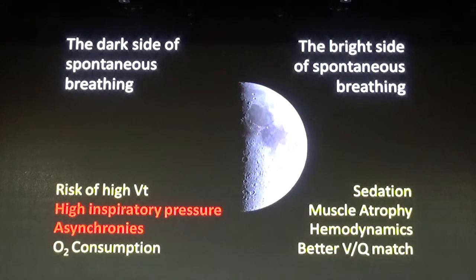But especially we have the risk of high inspiratory pressure and asynchronies. And just for, as I said, since it's impossible to mention everything, I will try to focus my talk on these aspects, just to show you how this should be monitored in the clinical practice.